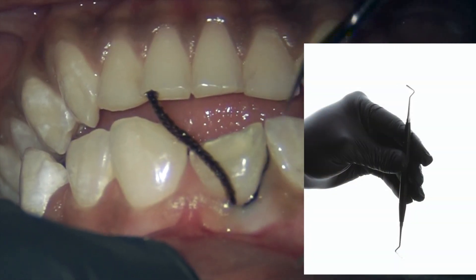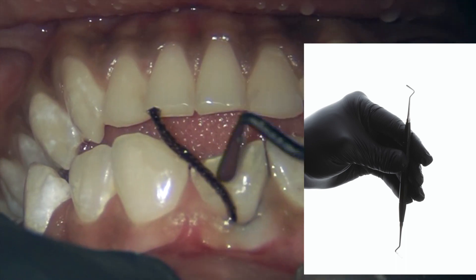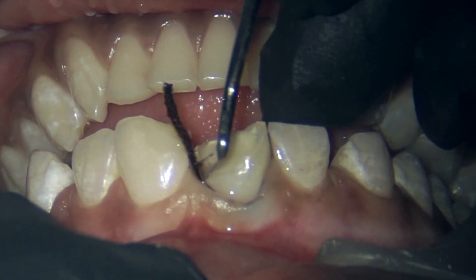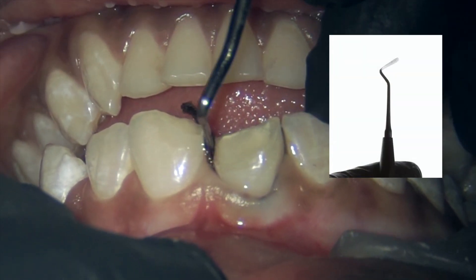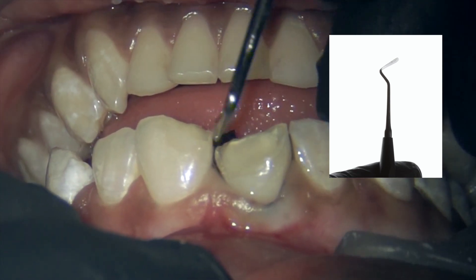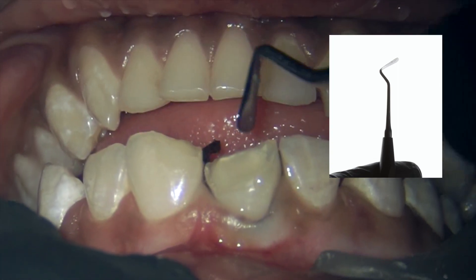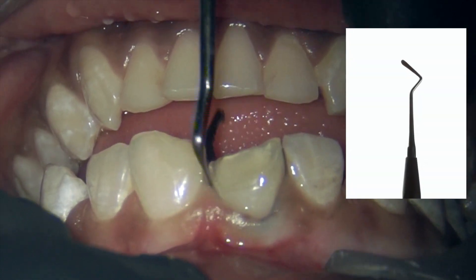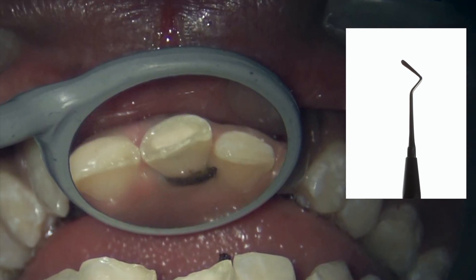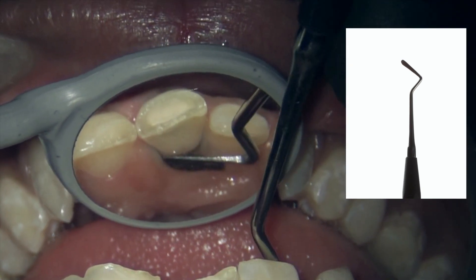This is the cord packing instrument — it's very useful. You can do this procedure with any plastic instrument or even a spoon excavator, but I would recommend you to use these cord packers to place it, because the instrument is at such an offset angle it's very convenient to place a retraction cord. It has two ends and you can choose whichever end is needed for that particular surface.